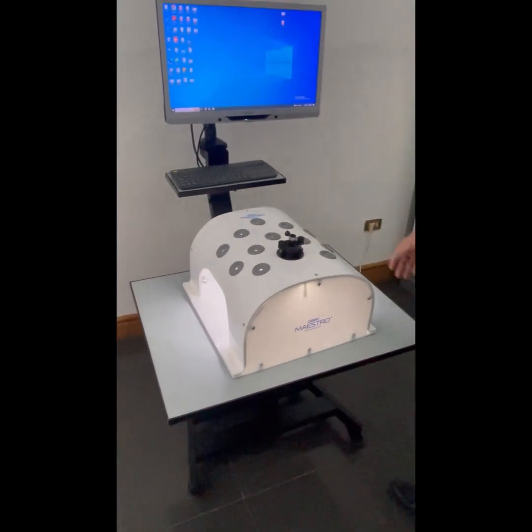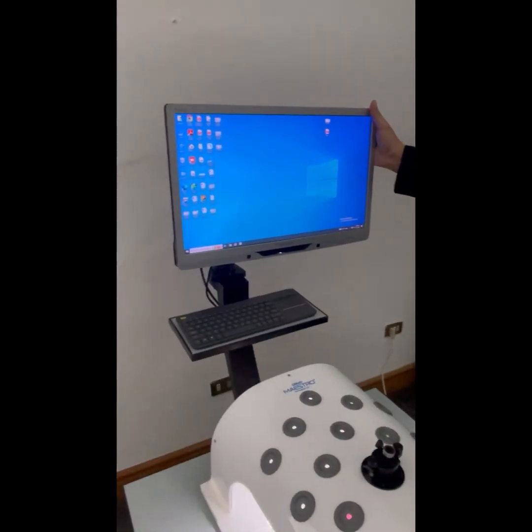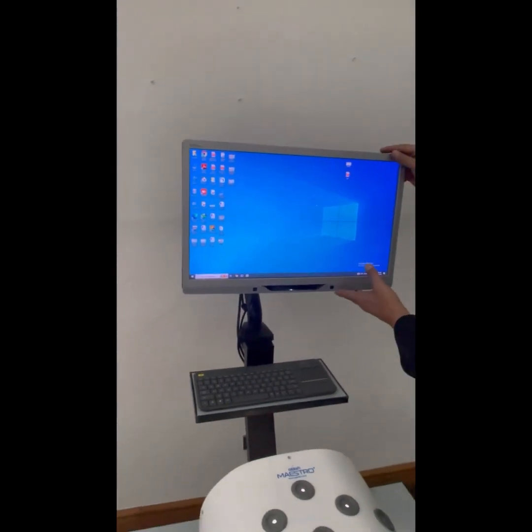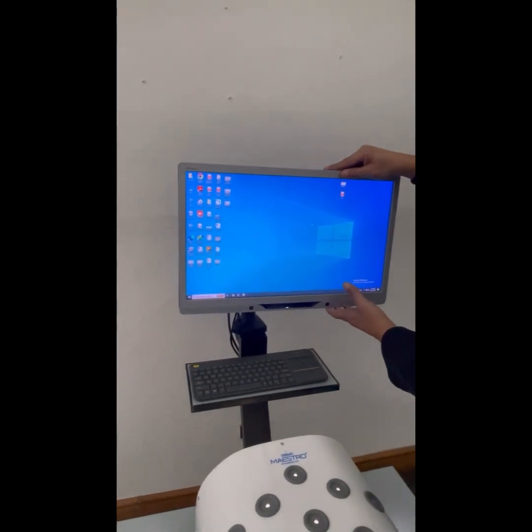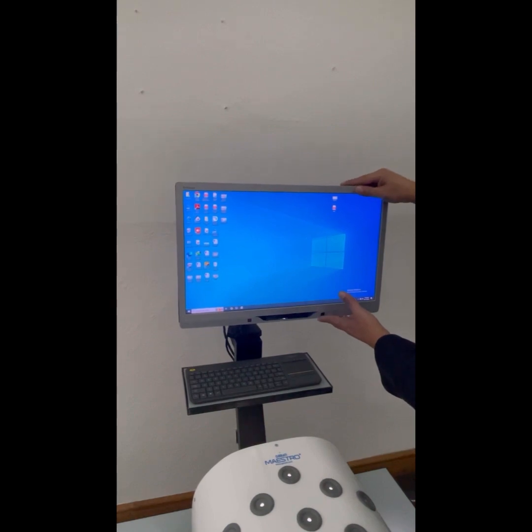Another feature of this laparoscopic training system is our height-adjustable LED monitor. It can be raised or lowered to any particular position and will hold its position wherever you want to keep it, according to the height of the user.